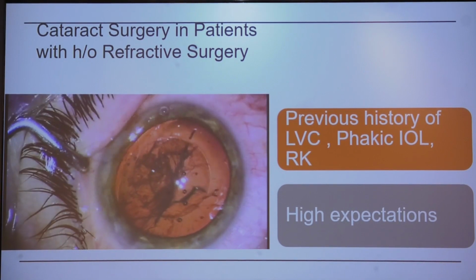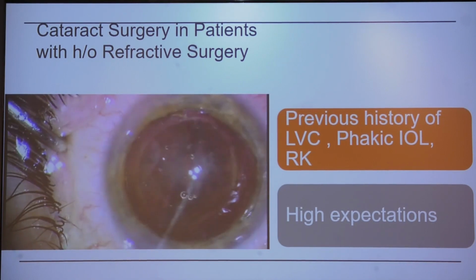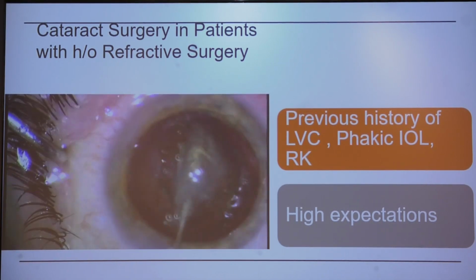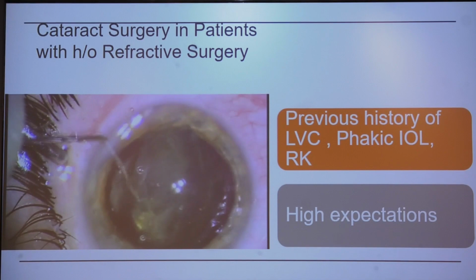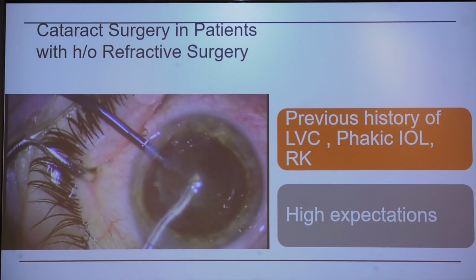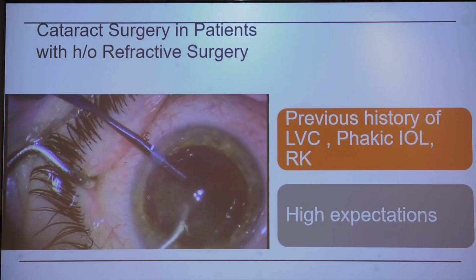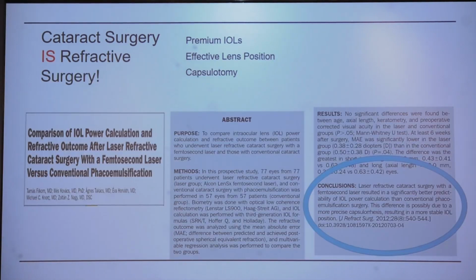I actually, just like a regular IOL, I just cut it, not apart, but I just make different cuts in it, and then I just twist it out. And again, the same sort of method used here with hydrodissection, hydrodelineation, use of additional dispersive viscoelastic. I always do a bimanual technique, both for my phaco as well as my IA. And then you can place a toric lens or an EDOF lens or whatever you like there. In the case of a cornea transplant patient, I don't use any multifocal or EDOF technologies.